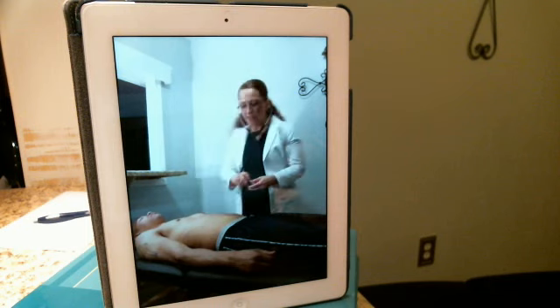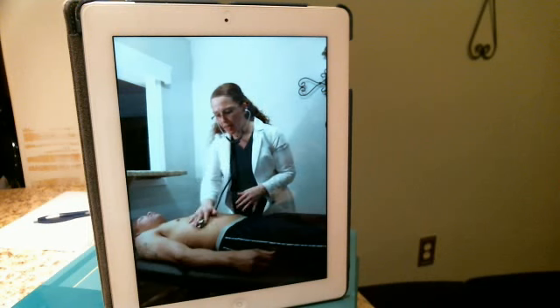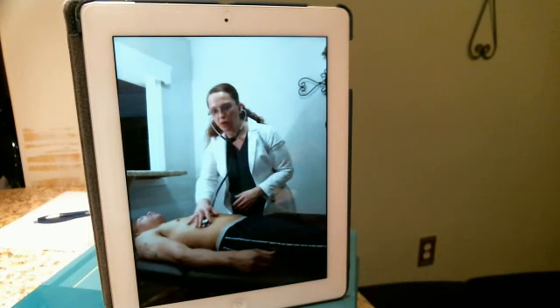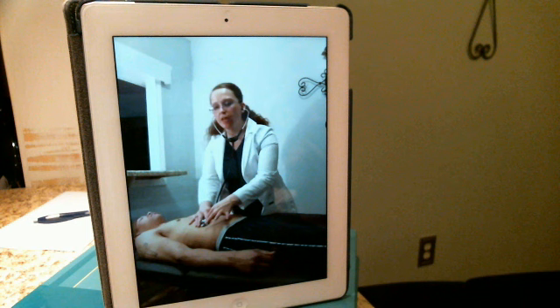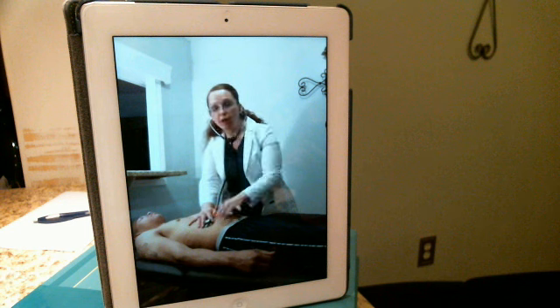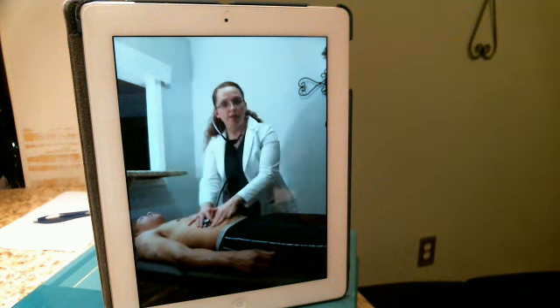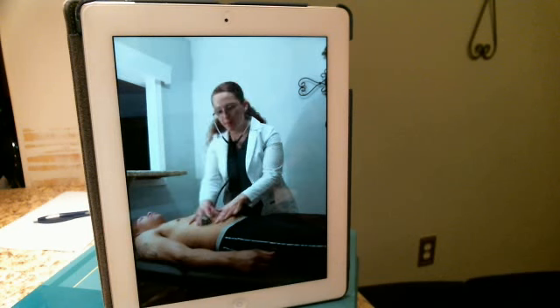Now at this point, to finish up his abdominal exam, actually you can place your stethoscope on the right upper quadrant area where you think you should be palpating the liver, and you can actually bring your finger up, dragging it across his abdomen, and you'll hear a scratching sensation whenever you get over the liver, and that will let you know where the bottom side of his liver is to palpate.